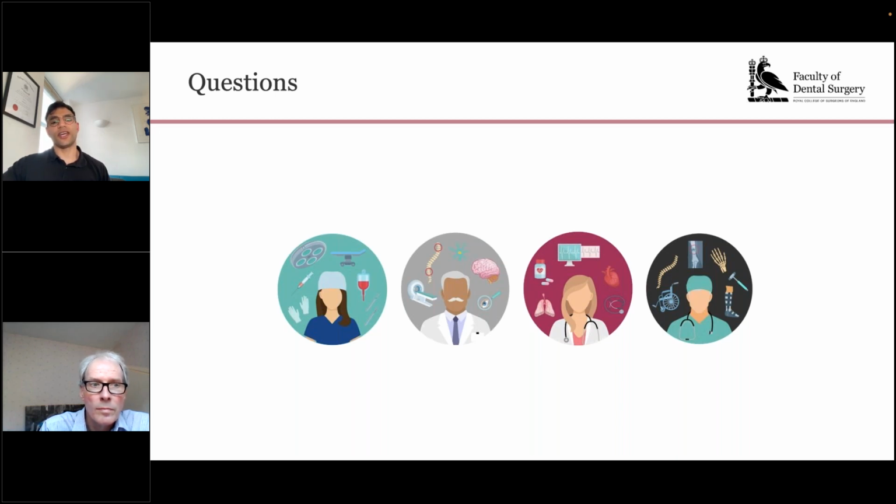Yeah, you've got to be very careful with photographs taken on smartphones. At that point, you might say, well, what if I use a smartphone just for the clinic? And if you're going to pay for a smartphone just for the clinic, you might as well spend the £700 or £800 and get a proper camera setup that will take far better pictures and have far fewer medico-legal and data implications.